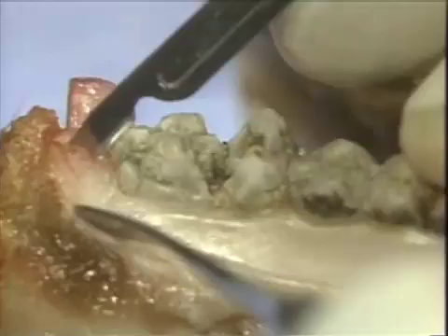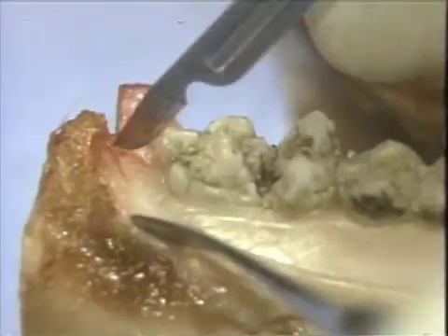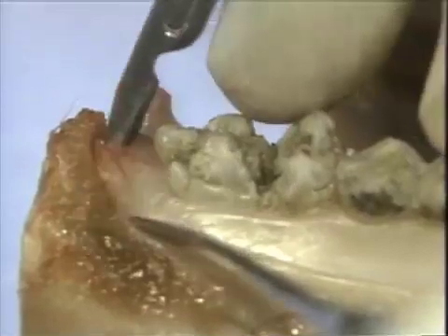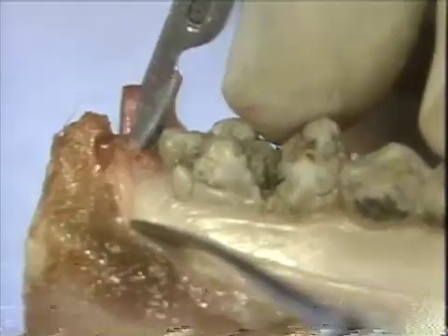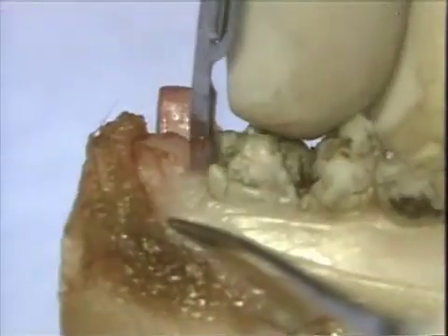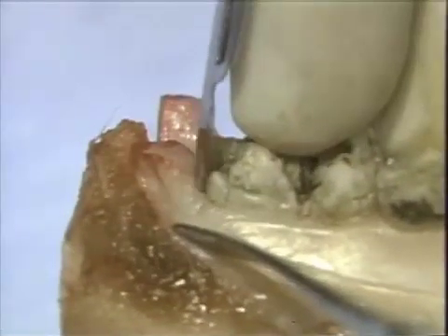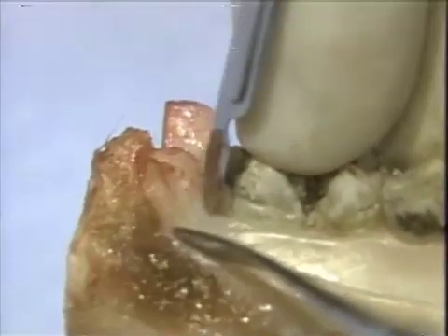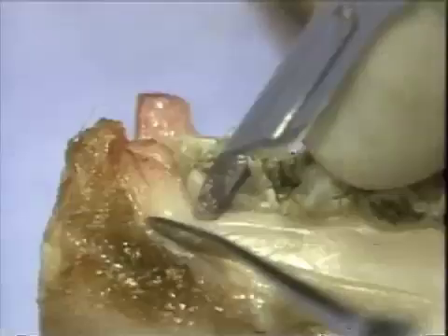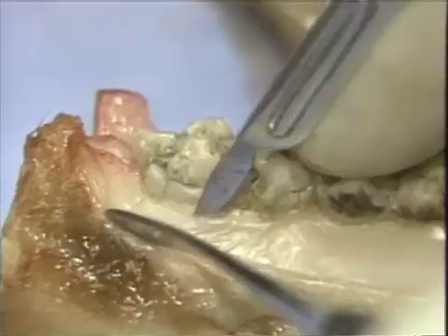In a similar manner, the buccal flap is elevated using sharp dissection and undermining thinning incisions which contact underlying alveolar bone. The incision is continuous along the distal line angle of the terminal tooth and can be extended to blend with the anterior flap.